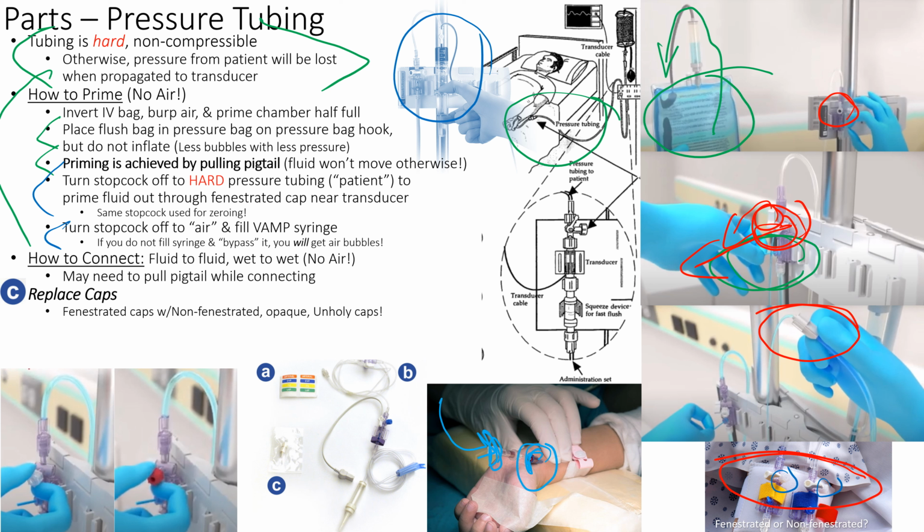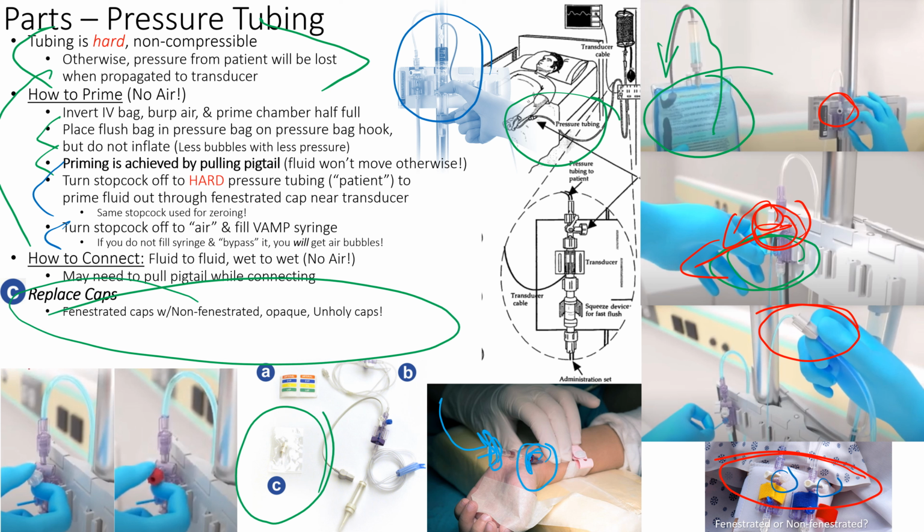And the last step, again, is replacing the caps. So make sure all the caps are replaced with the unholy caps, right? Not the holy ones. It comes holy, and you have to unholy it.